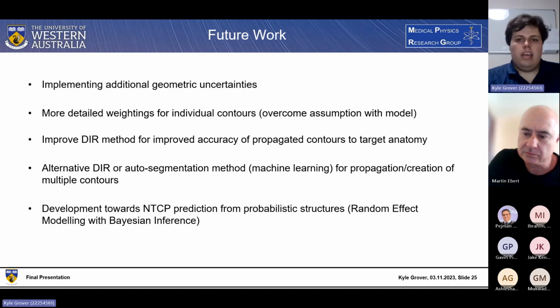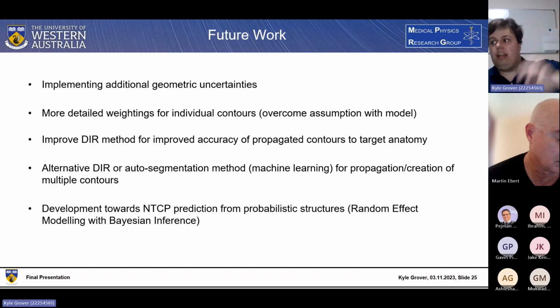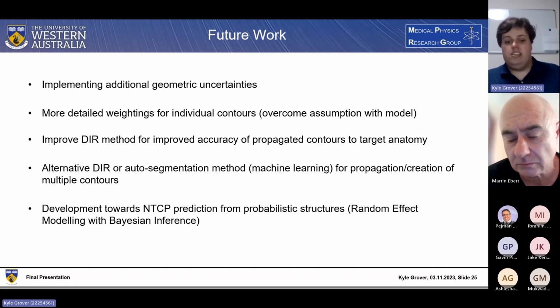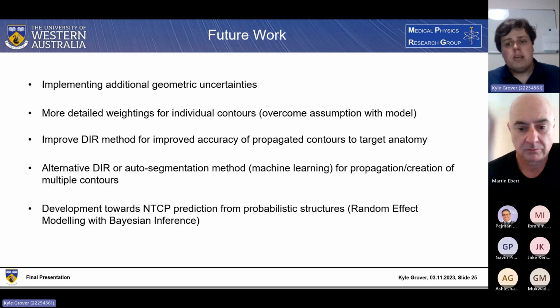Absolutely. Because we're considering the DVH, you're relying on a single binary contour that precisely defines the structure. Though maybe not entirely directly, this provides a little more spatial information. There are regions of particular concern, like in NTCP prediction, where we're specifically worried about the dose received by the rectal wall in close proximity to the CTV.